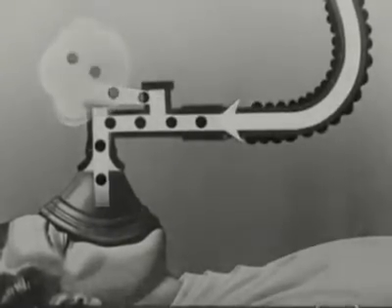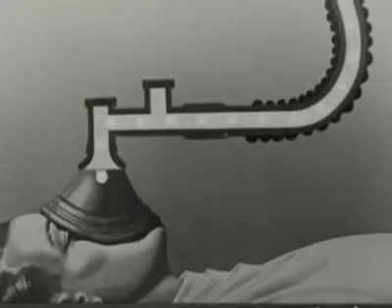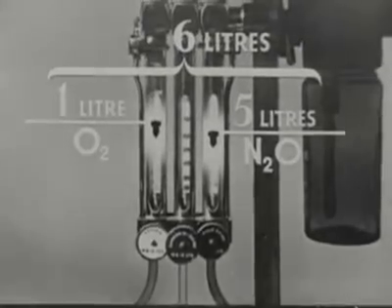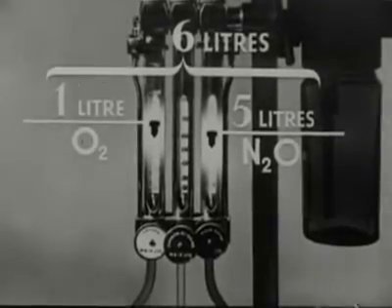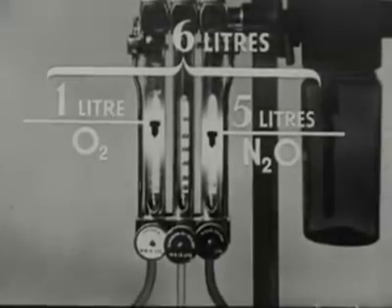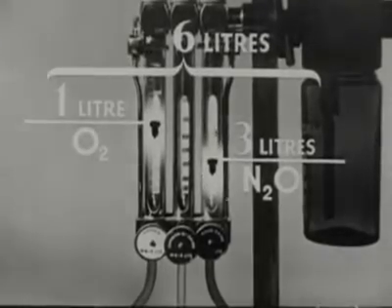The proportion of carbon dioxide breathed in is moderate, and at a flow of 6 liters per minute, a reasonable amount of rebreathing is maintained. If, however, the rate of flow of fresh gases is lowered, rebreathing will increase.